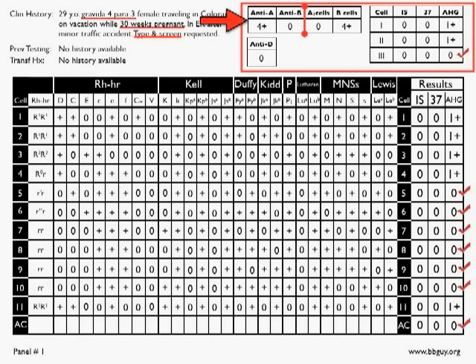Basically, this particular one shows that the individual has an A antigen on her red cells, and on the right side of that little dumbbell is the reverse grouping, or the serum grouping, which shows that this person has an anti-B in her serum. That goes along with the person being group A. Remember, if you look at forward and reverse grouping, the reactions should be opposite of each other. In other words, to the left of the dumbbell, we have positive, negative. To the right, we have negative, positive. If those are opposite of each other like that, then by definition, you don't have an ABO discrepancy in the vast majority of cases. Okay, so we would interpret that as group A.